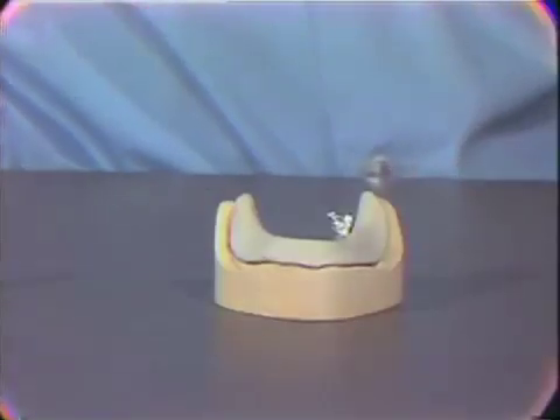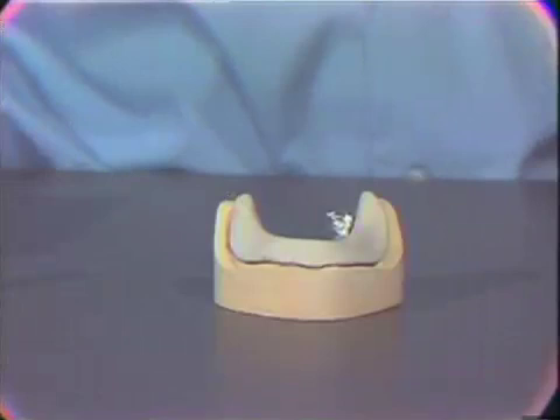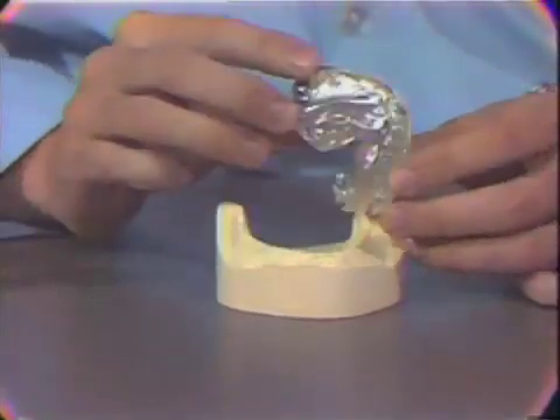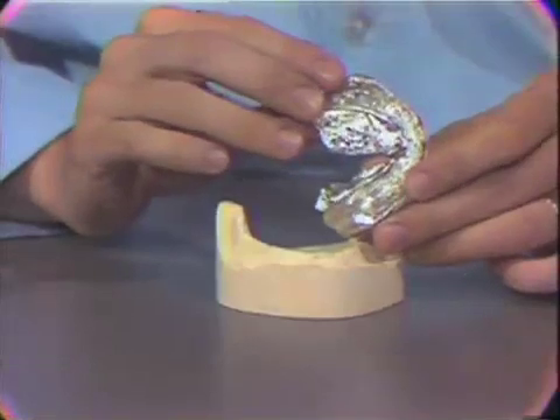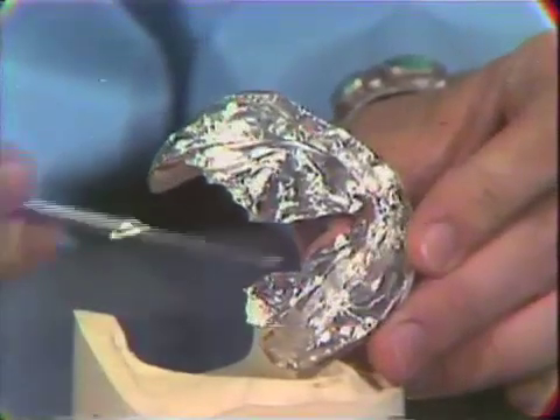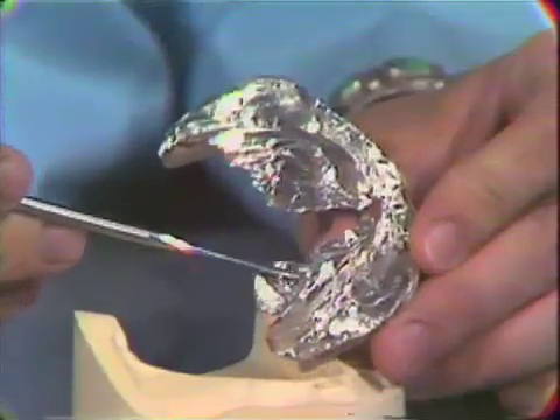We have stabilized the acrylic resin mandibular base plate with the aluminum foil and the light-bodied rubber base. We have not, however, completed the trimming of the peripheral junction of these materials and would like to demonstrate that prior to beginning this exercise.